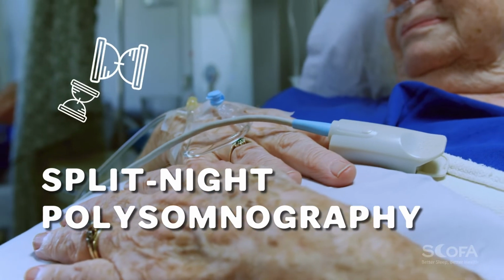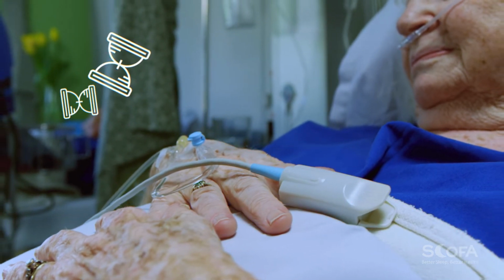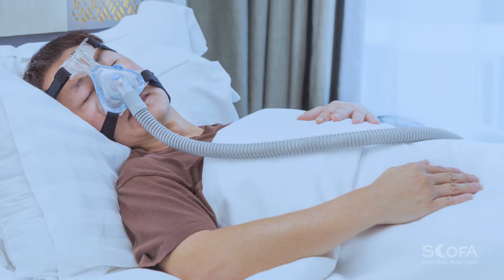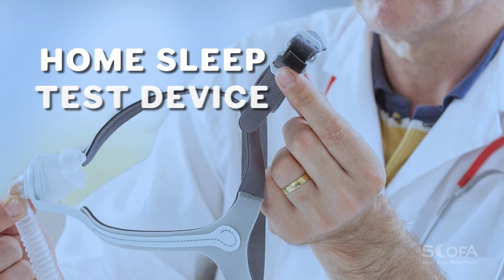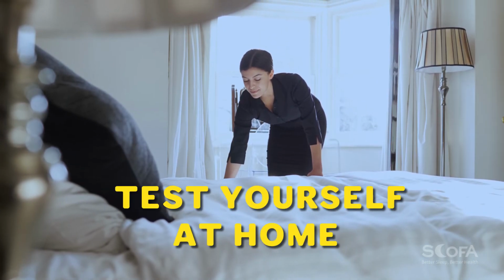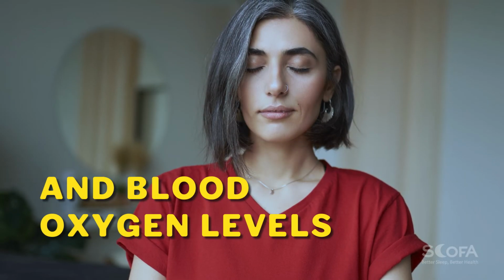In split-night polysomnography, diagnosis is done in the first part of sleep, which is usually 3 hours, and CPAP titration, if you're diagnosed with sleep apnea, takes place in the second part of sleep. 2. Home sleep apnea testing. This involves the use of a home sleep test device to measure physiological variables while sleeping. It's a method that allows you to test yourself at home without expert monitoring or having to spend the night at a sleep clinic. The device is attached to your body to measure your breathing and blood oxygen levels.